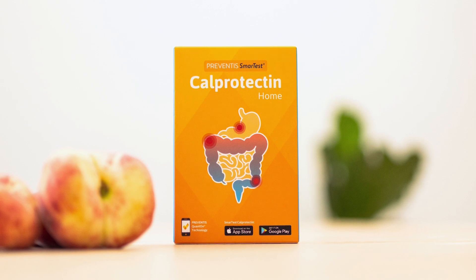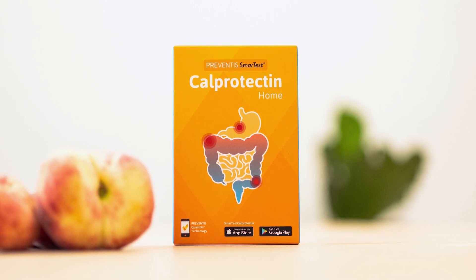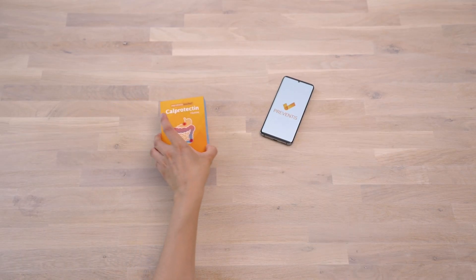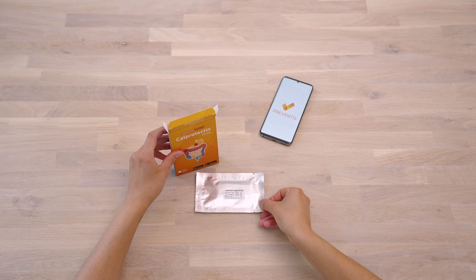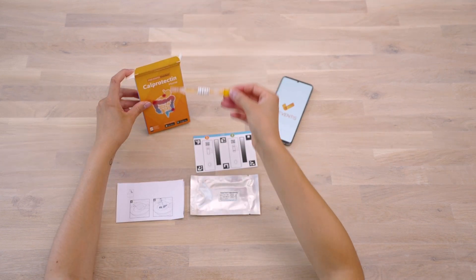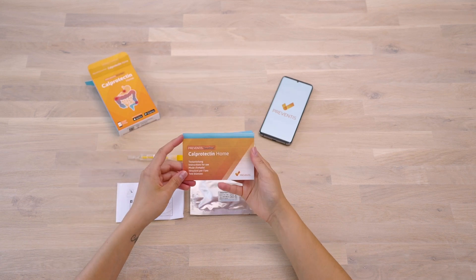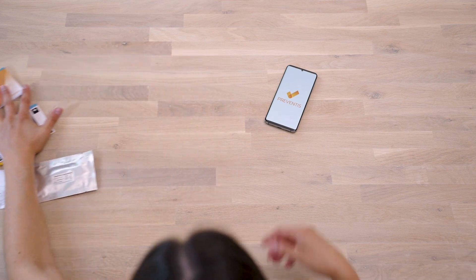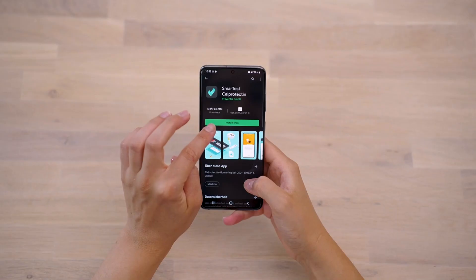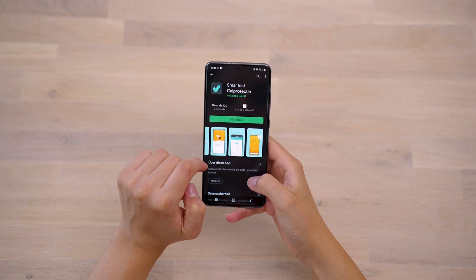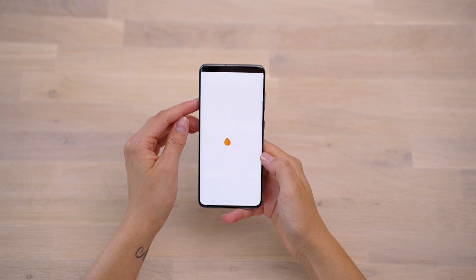To perform and evaluate the Preventus Smart Test CalProtectin Home Test, you need your smartphone and the test kit consisting of a rapid test cassette, a camera test card, a paper stool catcher, and a sample collection tube. Please read the enclosed test instructions carefully at the beginning. Then download the app Smart Test CalProtectin from the App Store or Google Play Store. Sampling, test performance, and evaluation are accompanied step by step by the app.